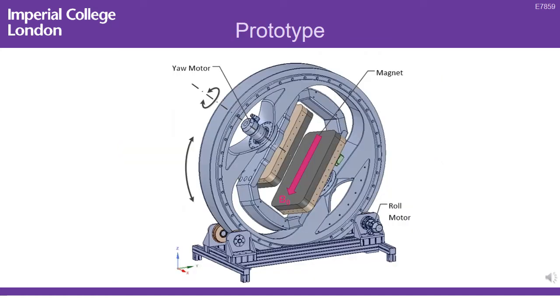The prototype scanner was designed with a permanent transverse field magnet and 2 degrees of freedom, or 2 planes of rotation, yaw and roll. The roll axis has a full 360 degrees of rotation, whilst the yaw axis had plus or minus 35 degrees, allowing for multiple combinations of orientations in order to cover the entire joint. The limiting factor of the yaw rotation will be the patient's limb, which will go between the 2 parts of the magnet.